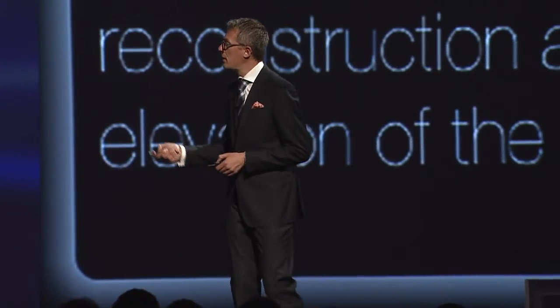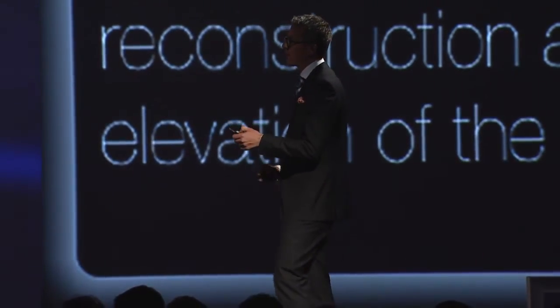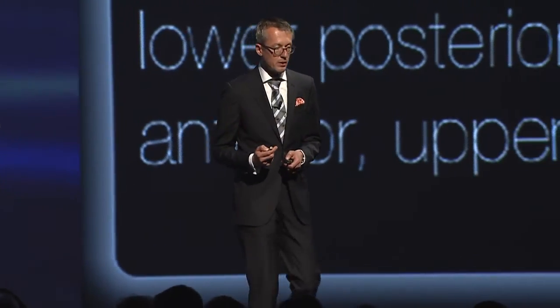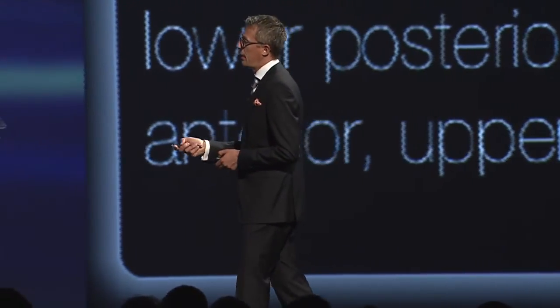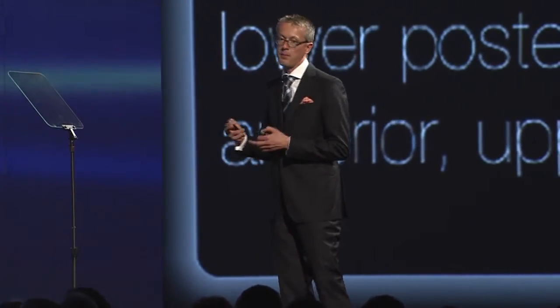And it's easy to do the preparations and to use the OmniCam, scanning the complete arch in one workflow. But as I mentioned before, I had to do the treatment in several segments because I just had the BlueCam camera. So I had to start with the lower posterior on the right side, on the left side, then the lower anterior, then the upper anterior.